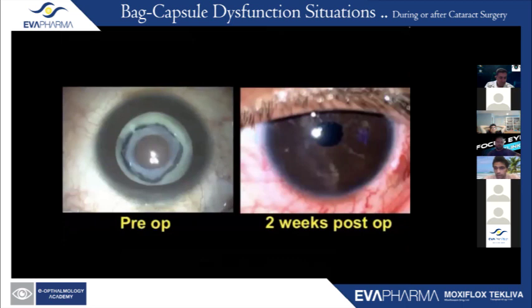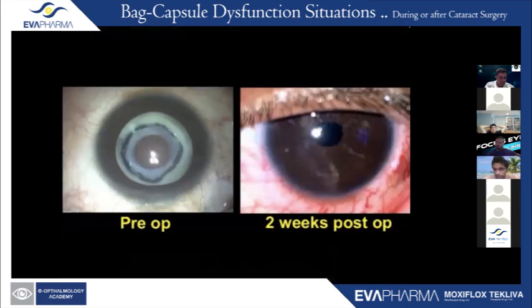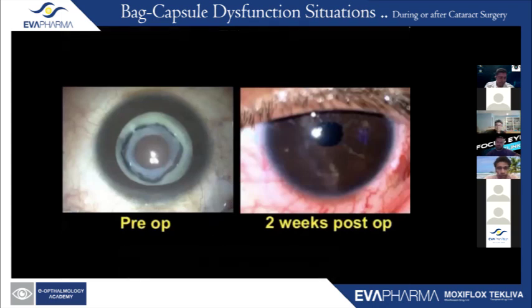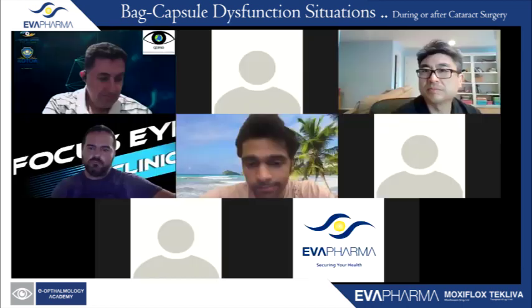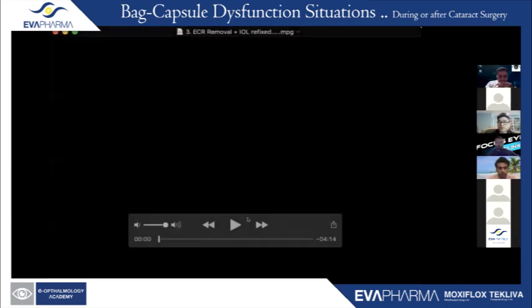The next case I wanted to show you guys was, it's a special case. I think it's an interesting one, and I'm only taking time because I have to show it in a different share screen. All right, here we go.